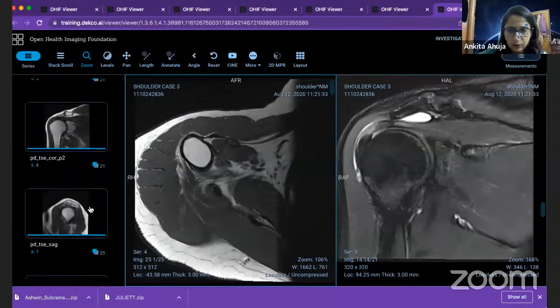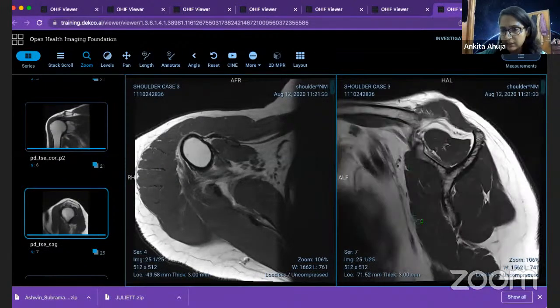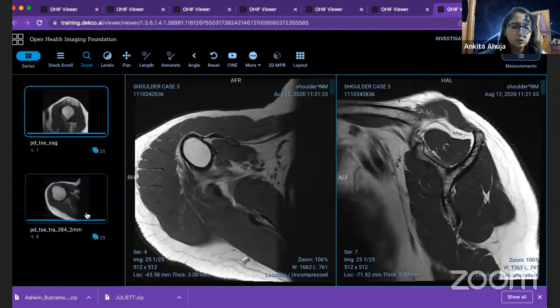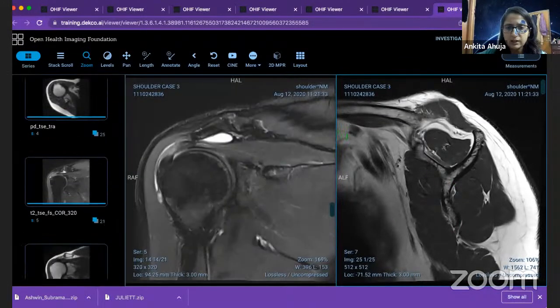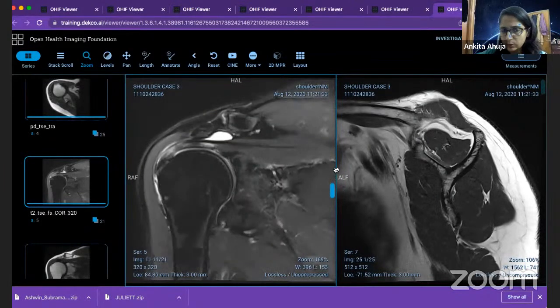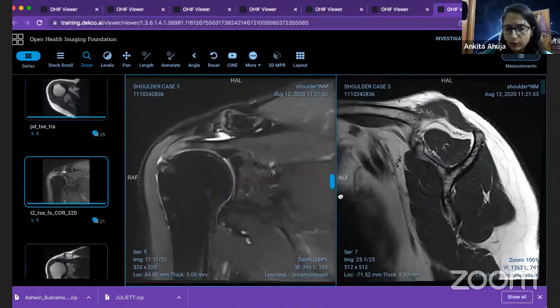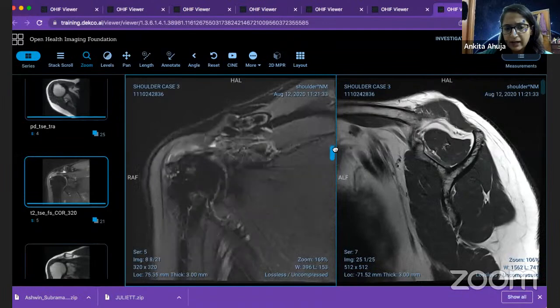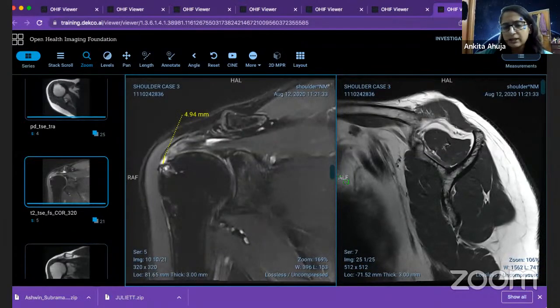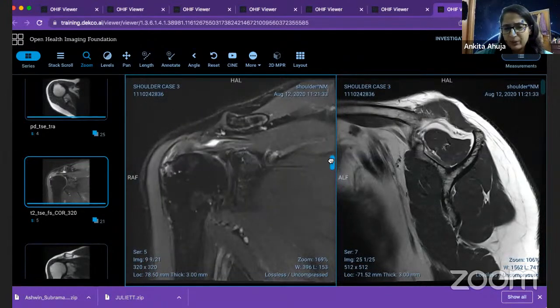And lastly, or maybe during the evaluation of supraspinatus, you look on this image if there is any muscle volume loss or fatty infiltration. So kind of everything looks overall fine over here. So to conclude this case, what all we figured out: that there is moderate supra and anterior infraspinatus tendinosis, and a partial bursal-sided supraspinatus tear with moderate subacromial bursal fluid, and there was mild intra-articular biceps tendinosis, and there was mild posterior superior labral fraying, which you see often in elderly patients.